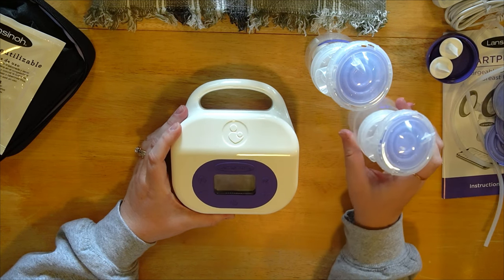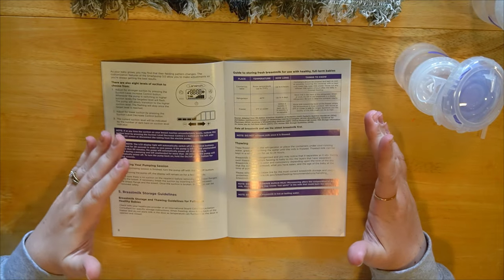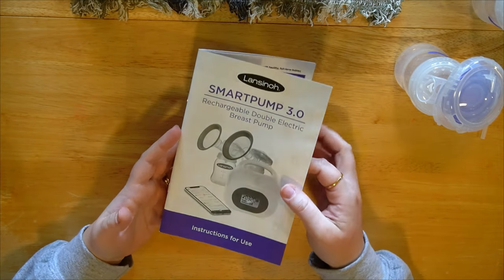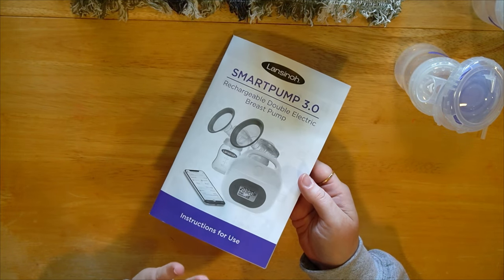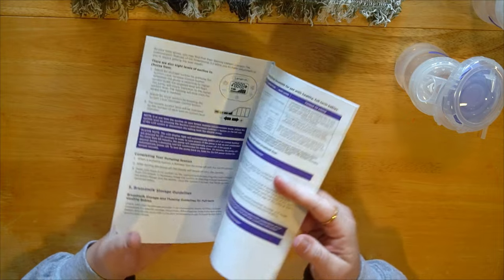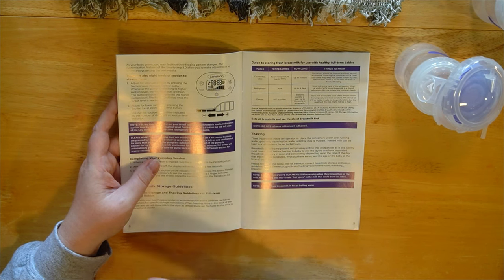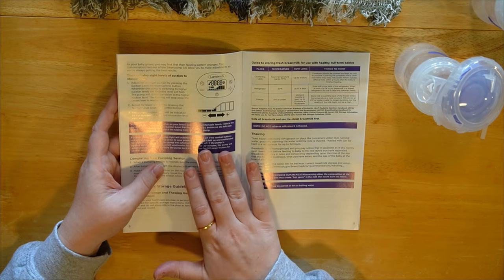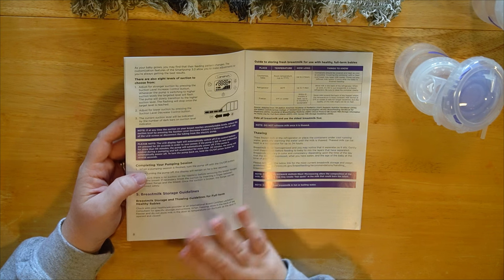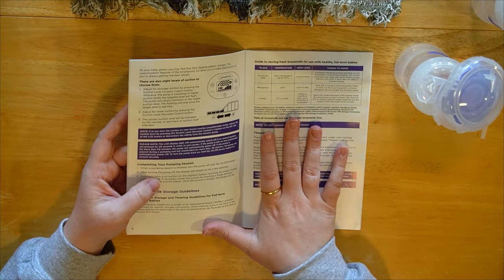I'll show you how to reassemble everything and go over what cycle rates to use. They did a great job with this owner's manual — it has a section on how to size your flange and everything is very detailed. It says if no buttons are touched after 20 seconds the LCD screen will dim and turn off to save power. Also, if the pump is on for 60 minutes it automatically kicks off, and if you press the power button to pause after 20 minutes it'll also shut off.